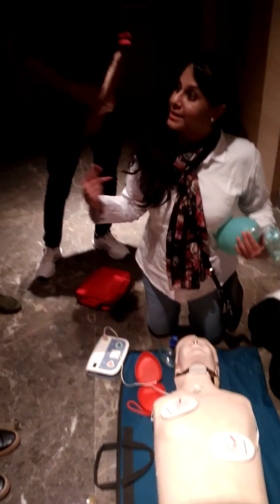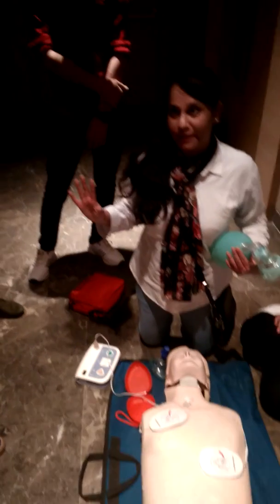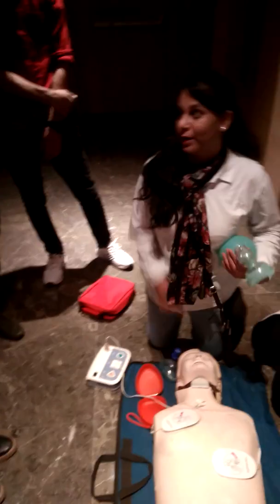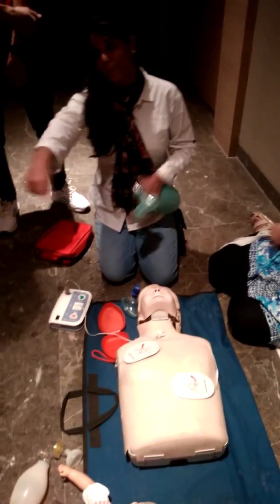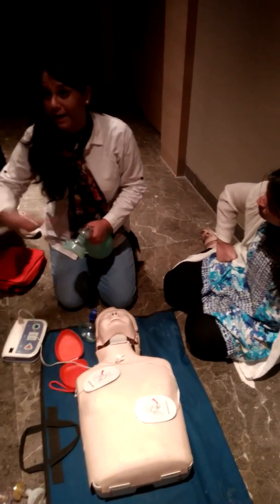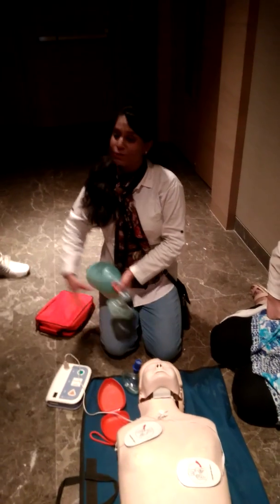After every 2 minutes the machine will again say: analyzing heart rhythm, do not touch her. Now I am tired, so she will shift her position from the chest to the head end, and I will shift my position from the head to the chest. We never cross positions — she shifts from here to here, and I shift from here to here. These items will remain at the head end so they can be operated by either rescuer.